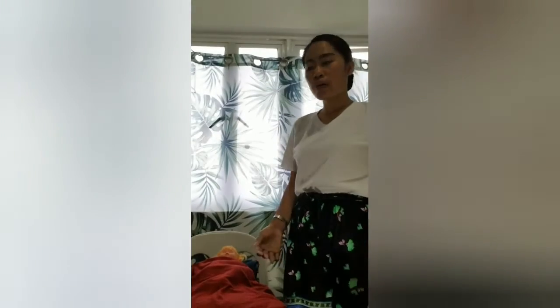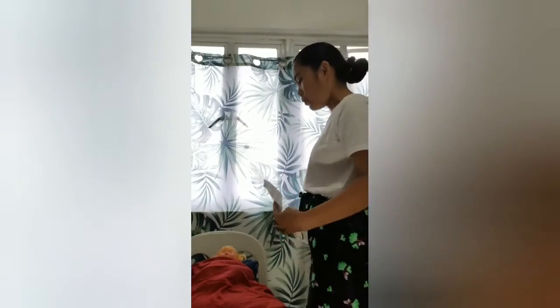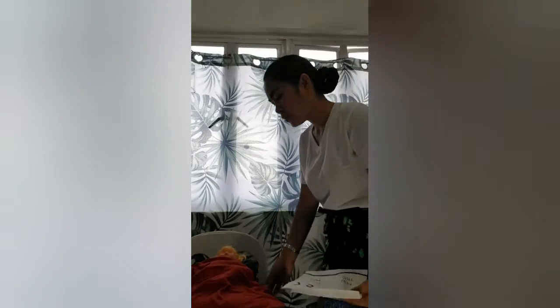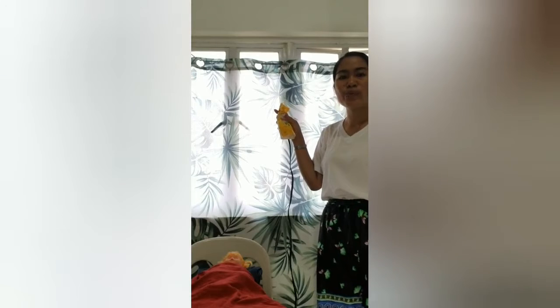Next, we are going to put the protective pad so it will protect the linen from being soiled. Sir, I will put the pad underneath. The next thing we have to do is hang the enema can on the IV pole, or just pretend that there is an IV pole here, and then unclamp the end of the tube to let the solution flow all the way through the tube.